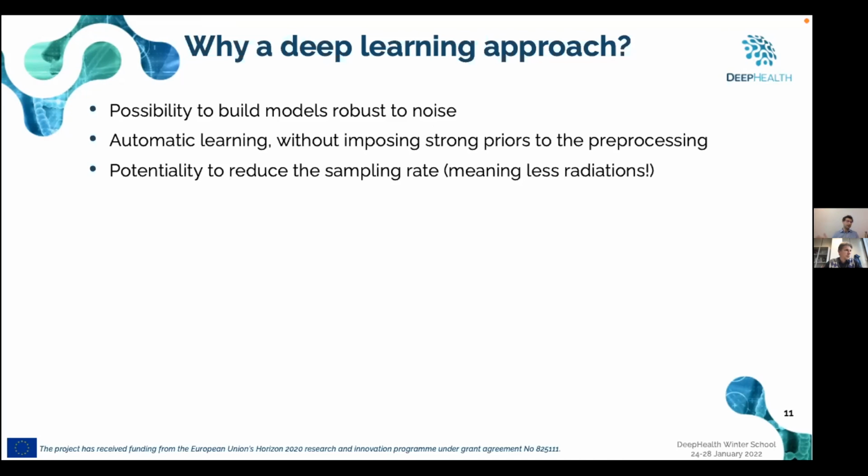Of course, image registration is still a good practice to deploy, but image registration is not always going to be a perfect method, because it can do just rigid transformation, but there are many other sources of noise from which this approach can fail.